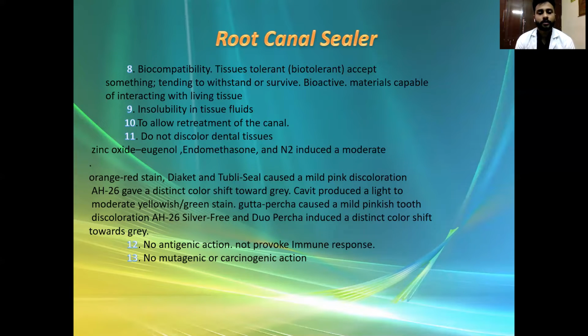The last two properties are that they should have no antigenic action, not provoking an immune response, and they should be non-mutagenic and non-carcinogenic.